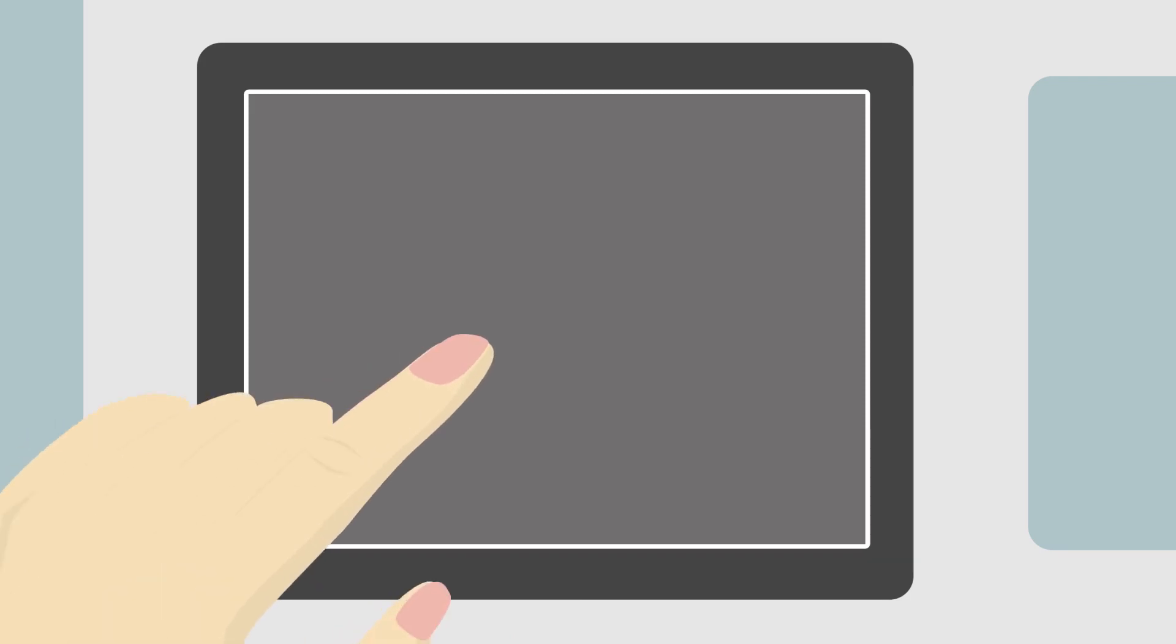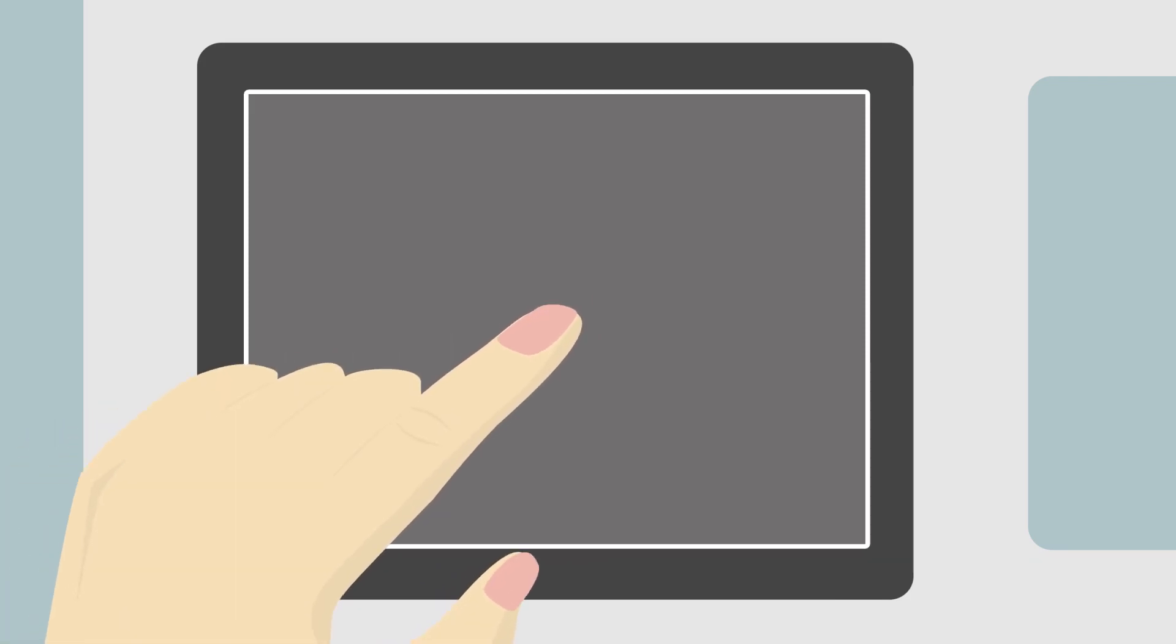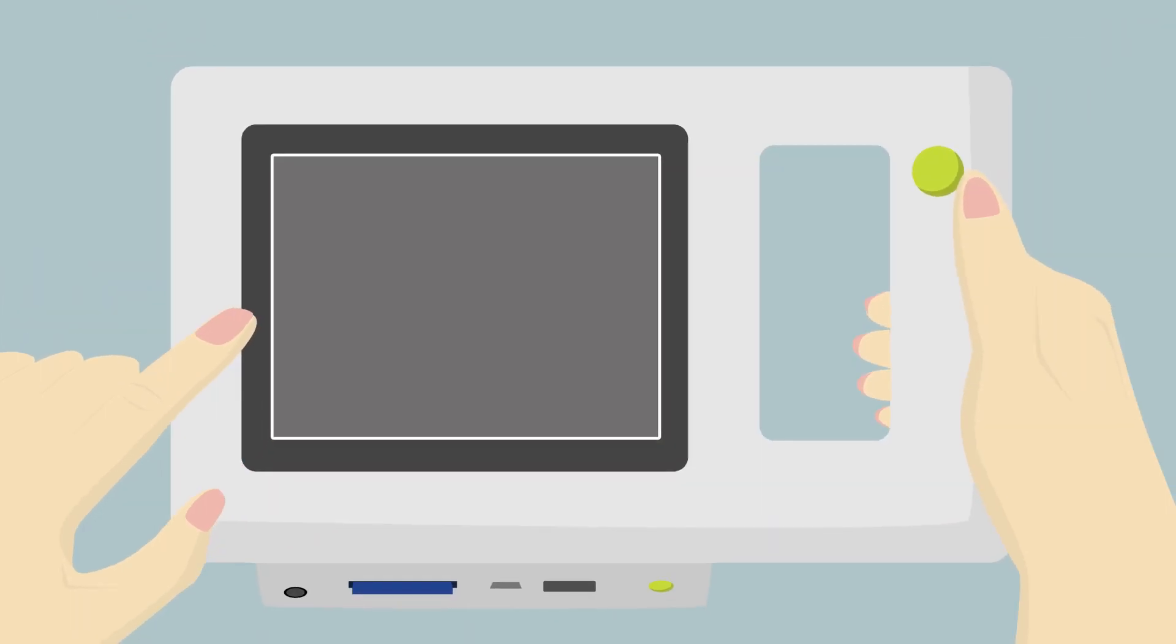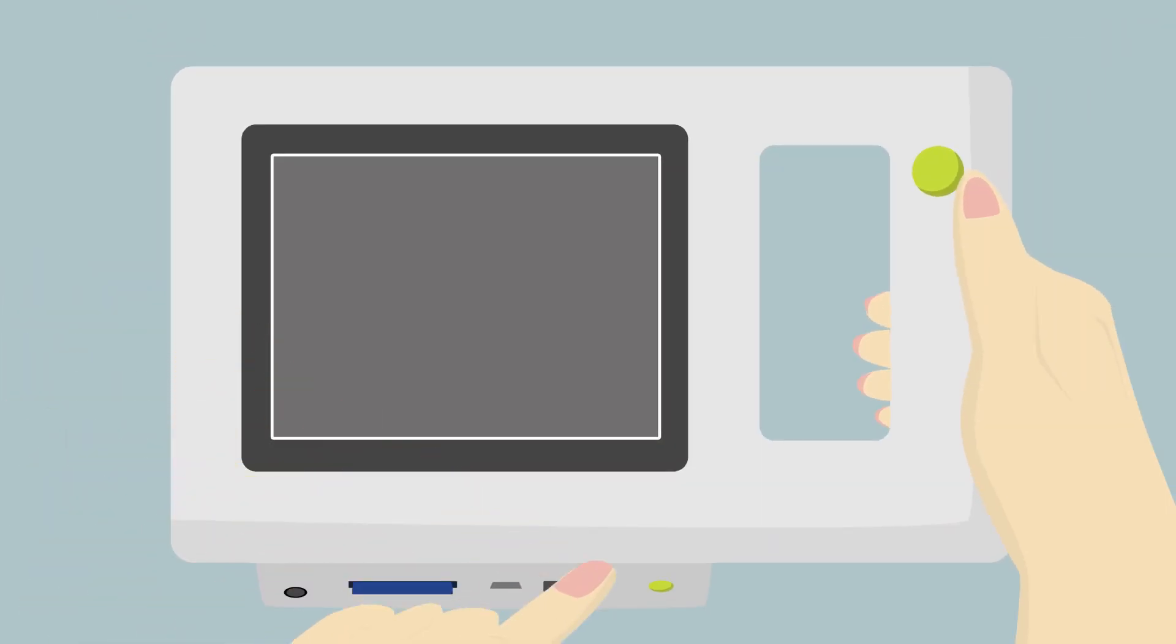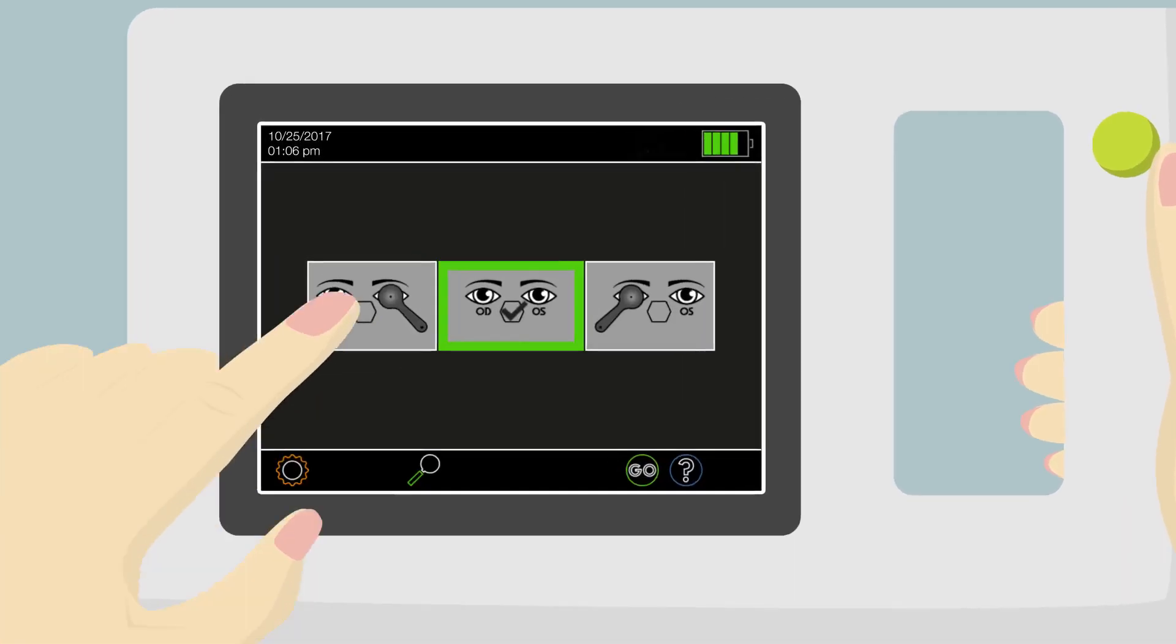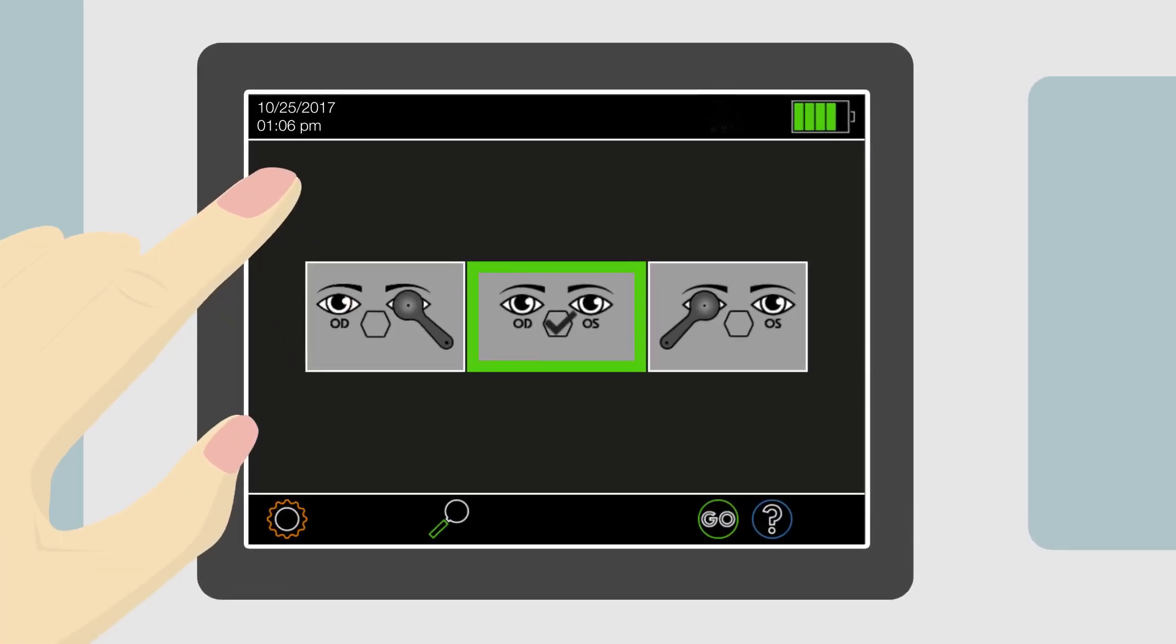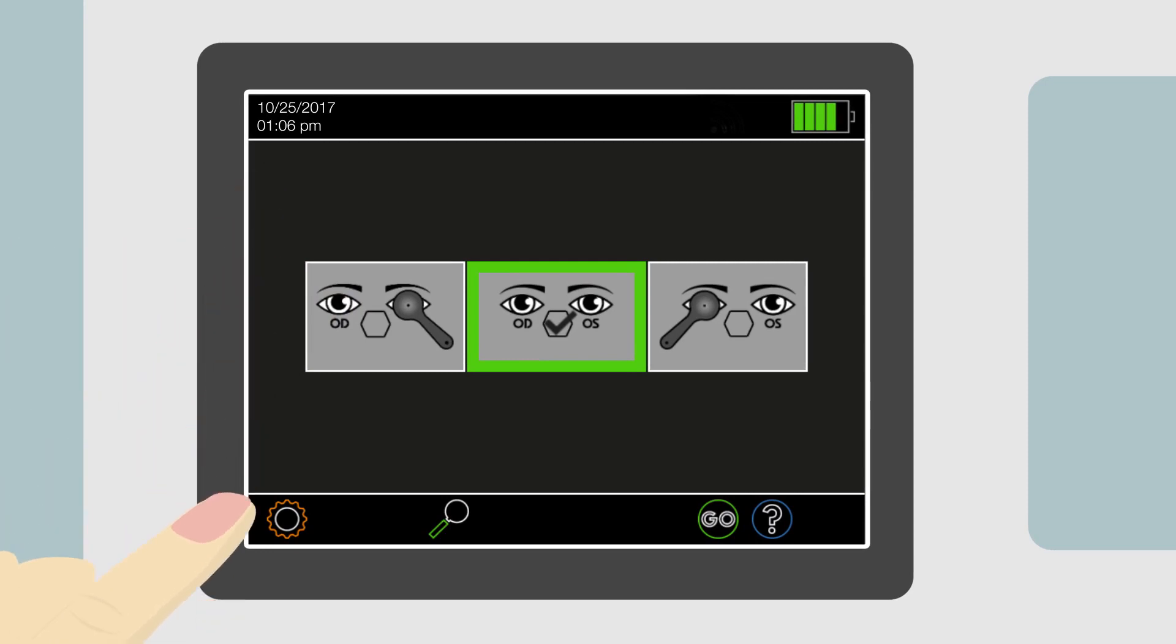If the screen does not illuminate again after touching it, the device may have turned itself off. If this is the case, the most recent screening result and ability to print it have been deleted. Press and release the power on button to restart the device. The screensaver and auto shut off timers can be adjusted on the settings page.